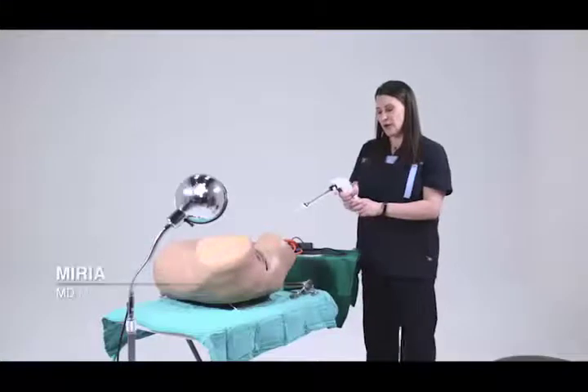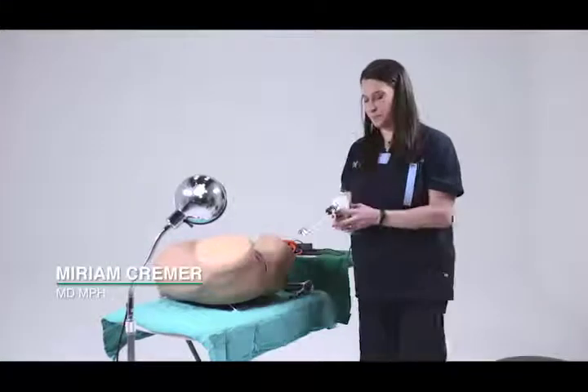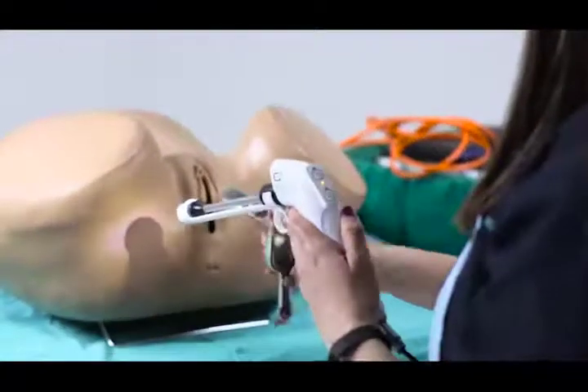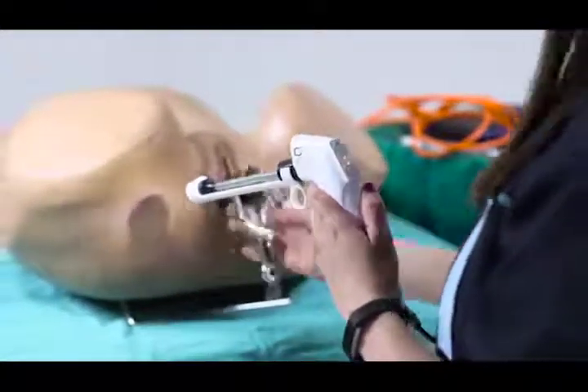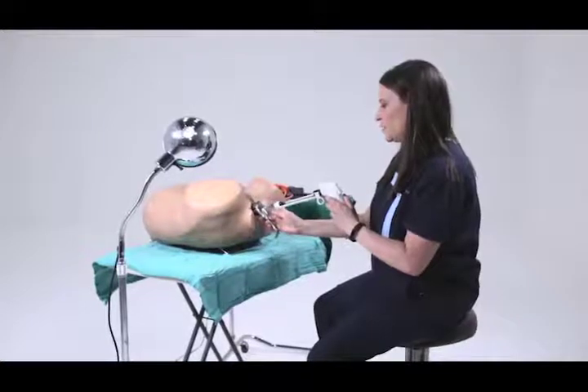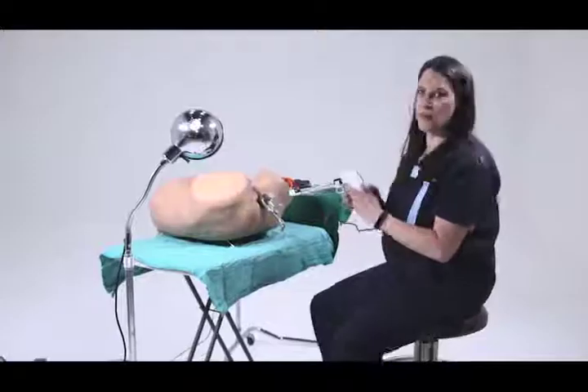The next thing you do is press the button and you'll see a little blinking light. The light will blink until the probe is hot enough to be used. Then you get your patient ready for the procedure and you wait for the light to stop blinking.